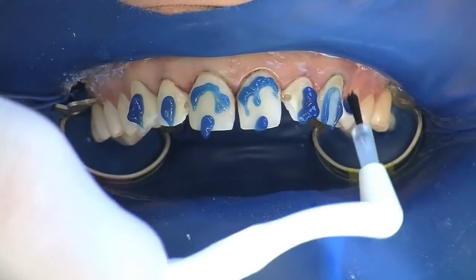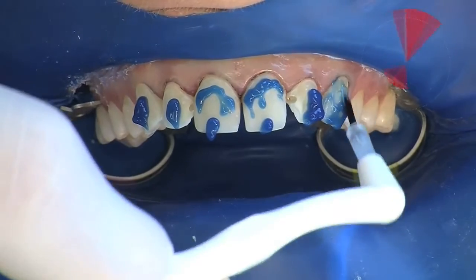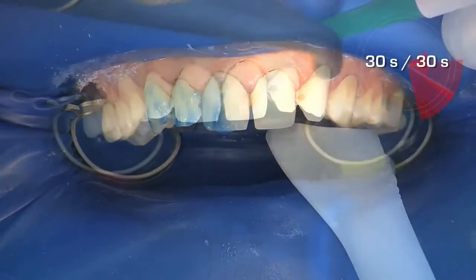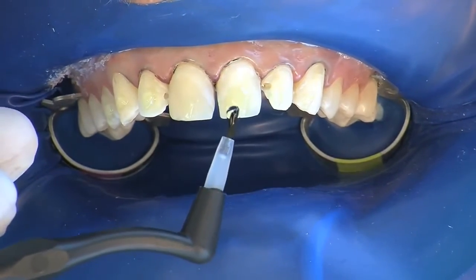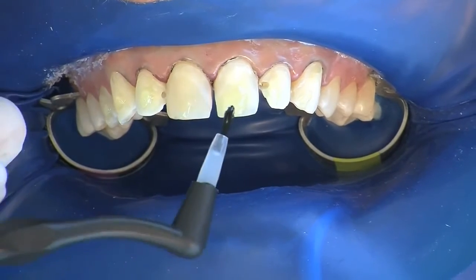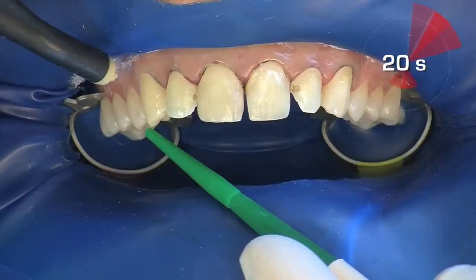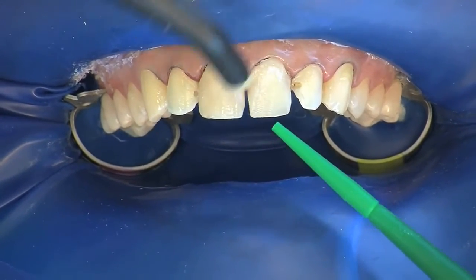The etching gel is applied to the teeth and distributed to all surfaces using a brush. After 30 seconds, the gel is thoroughly sprayed off for 30 seconds and air dried. One coat bond is distributed evenly to all teeth and massaged in, with a reaction time of 20 seconds. The bond is then blown to a thin layer and excess bond is aspirated.